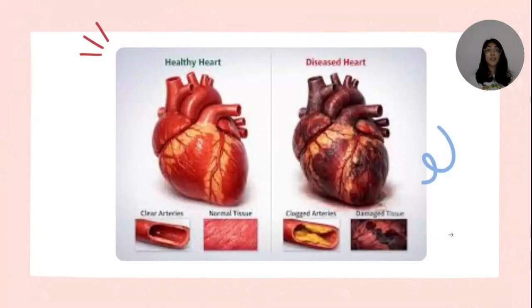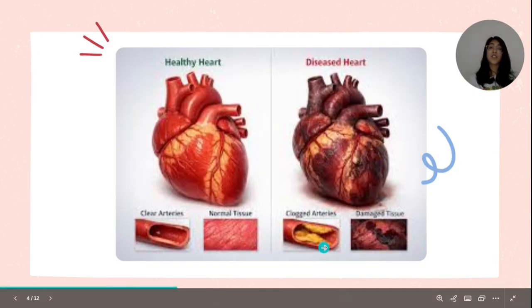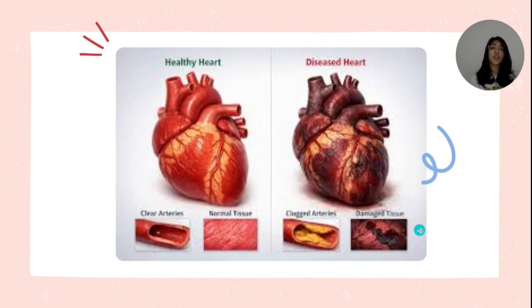Now, an LVAD may be used in the cases of these two hearts. As you can see here, the healthy heart has clear arteries and normal tissue. It's very uniform, meaning that it has relatively no struggle pumping all this blood. However, a diseased heart may have clogged arteries and/or damaged tissue, putting more stress on the blood being pumped.